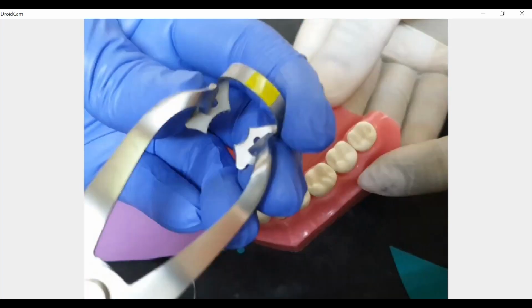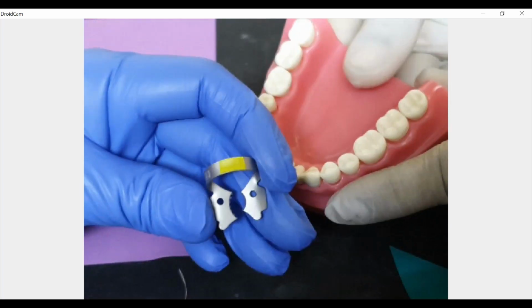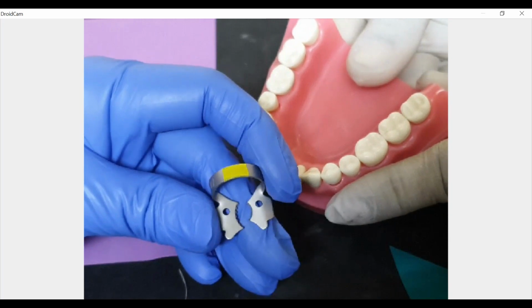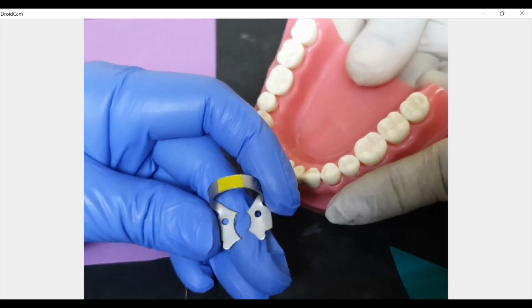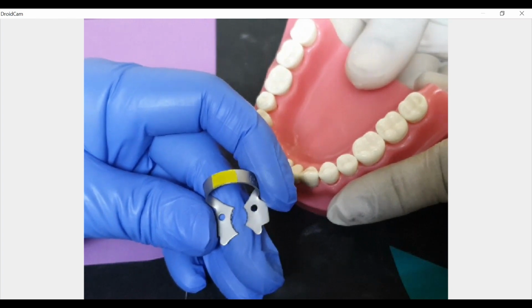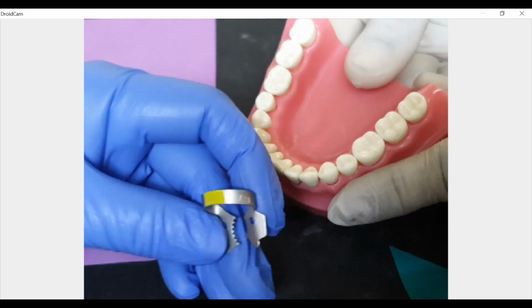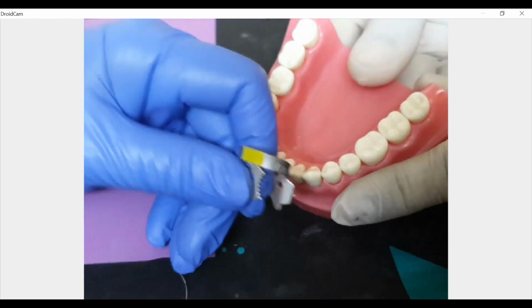So what is the next step? The next step is to secure the clamp. You can use a wingless clamp. Wingless clamp is a great choice for multi-teeth isolation. So in that case, you can choose one of the Brinkers, or you can use a wingless 8A, one of the options for your isolation. So you will secure the clamp.